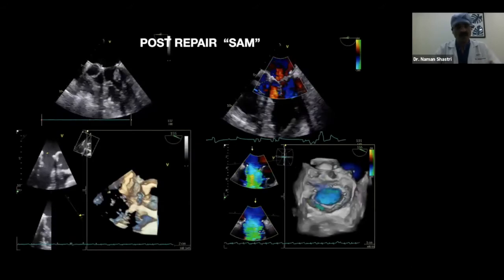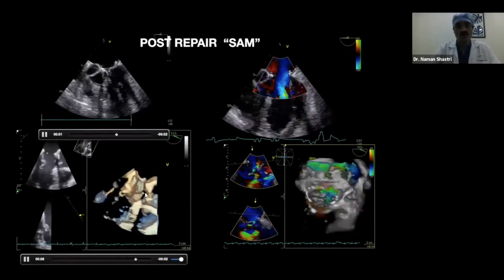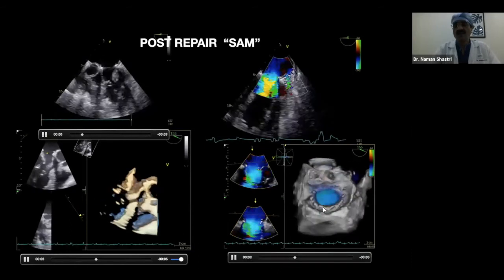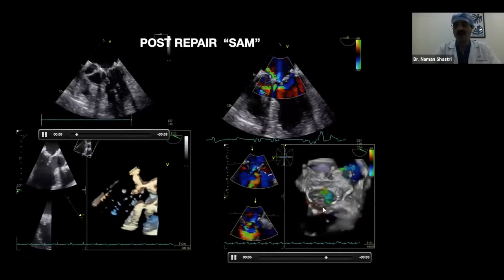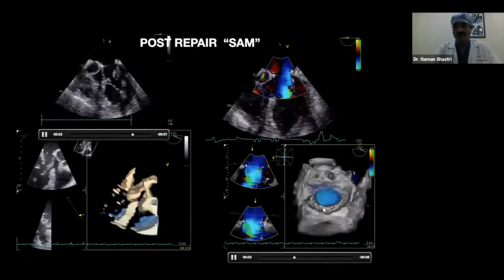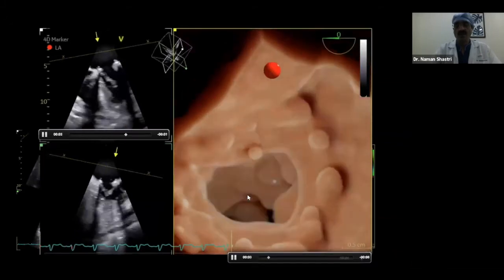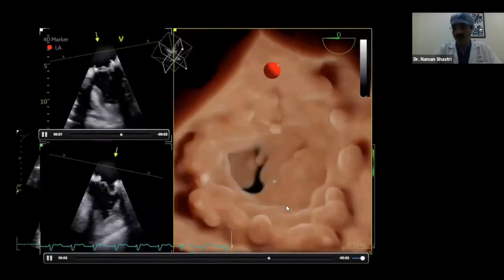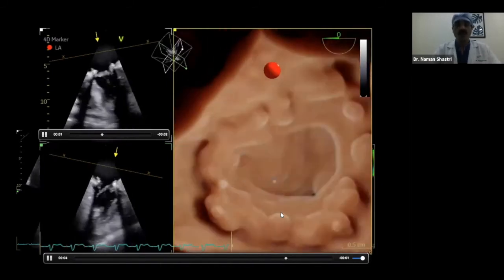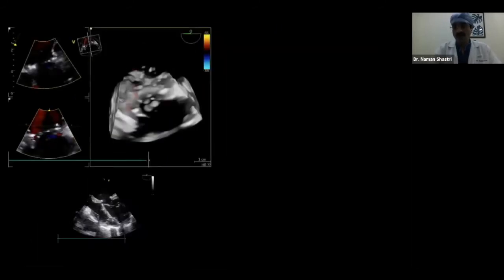Post-operatively, in this patient of repair, you can nicely see the SAM, systolic anterior motion, with both the tip and coapting going bulging into the LVOT, and you can see a very nice anterior jet directing. So we can go back on pump, and then we can advise a bigger size of annuloplasty ring, and ultimately the result shows a very nice anterior mitral leaflet touching the other part of the ring. The P3 part is also seen very well, and now the coaptation is going up to the level of the annulus, not going down to the LVOT.